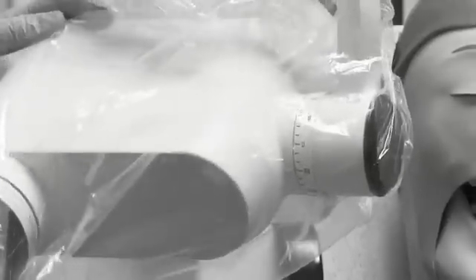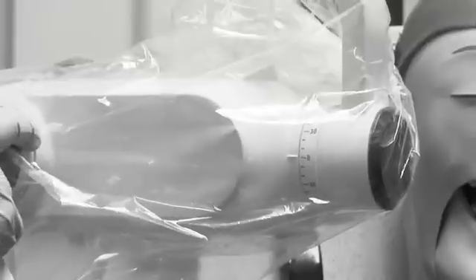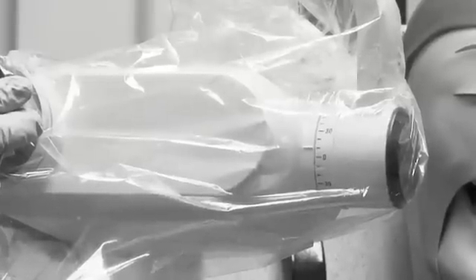On the mandibular arch, we're going to have our patient raise his chin up, and we're going to go from a minus 10 to a minus 15 to 20. We're going to stay at that all the way across the whole mandibular arch.